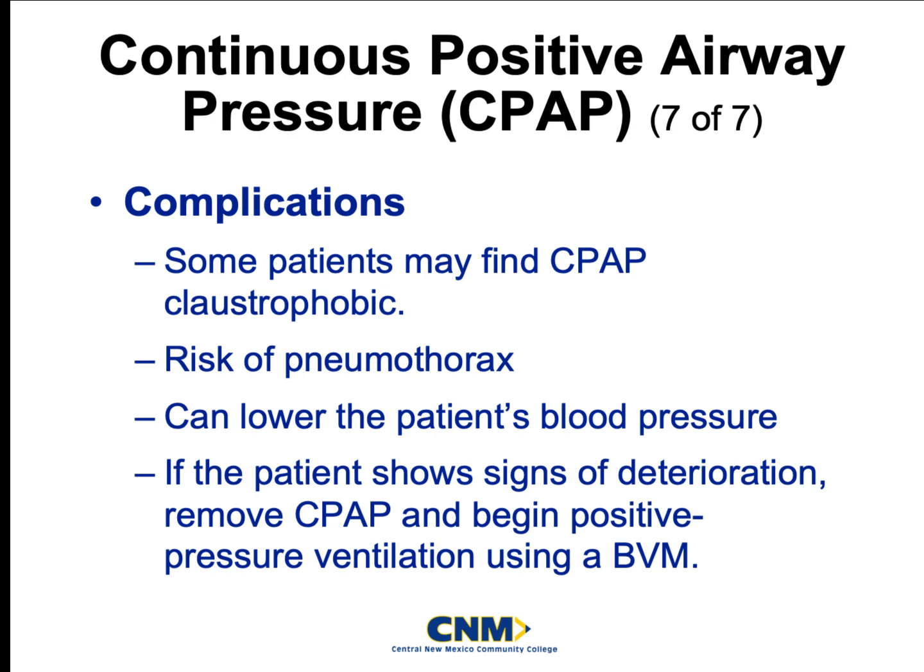So we have to have that good therapeutic communication. We have to build that trust with our patient, and we have to talk to them. Okay, they need to realize that this machine that I'm going to strap and hold down to your face, even forcefully if I have to, as soon as you start breathing in, it's going to help you out.